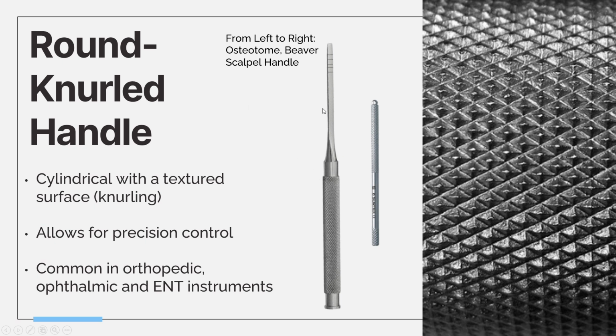And examples included osteotome, like I mentioned earlier. These are often used with mallets. So you would hold this end here with your hand and then smack this end here with a mallet, right, to chip away at bones, for example.